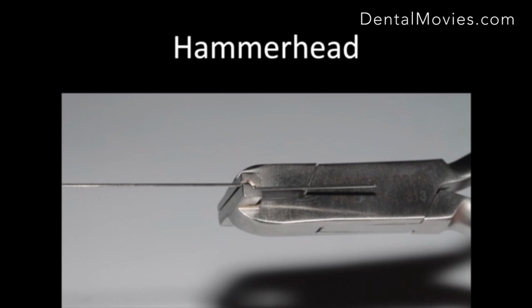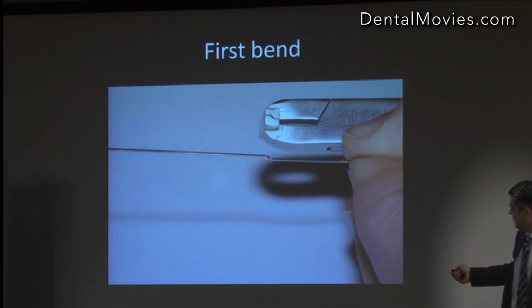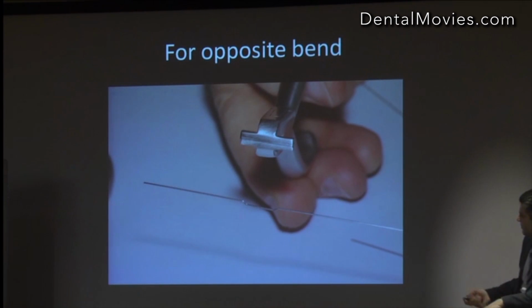It's also known as a hammerhead because it looks like a hammerhead shark. Correct term is step up, step down. It's also known as a first order bend plier, right? Just to confuse you. So if you just press it, what does it give you? The offset. So if you press it the way it's designed, it gives you a vertical offset. If you then grab the plier and turn it this way and bend on the other side, it'll give you the opposite bend. Do you understand? So that's a great way if you want to intrude a tooth.